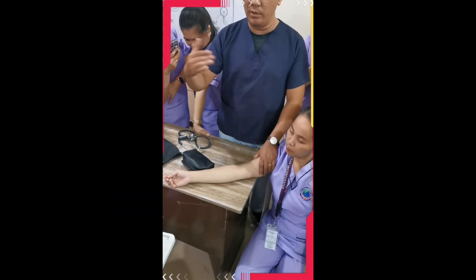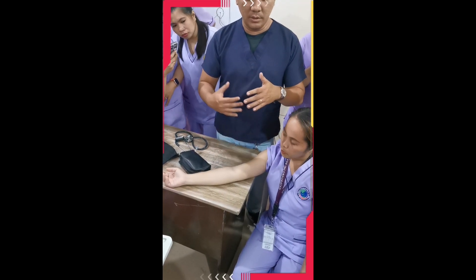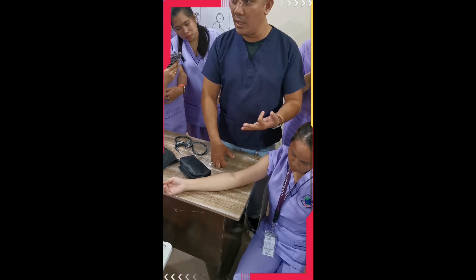There are a lot of things that you need to consider before you measure the blood pressure. Number one is your patient — specifically the age of your patient. Is your patient an adult, child, or infant? You have to determine whether it is infant, child, or adult.